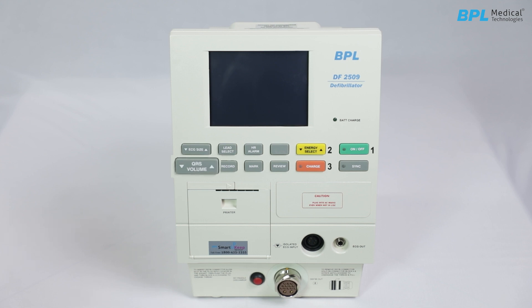QRS Volume: adjusts the volume of the QRS beep. Record: prints the current ECG data and status. Mark: stores the ECG data during printing. Review: prints an event summary record and stops the recorder during printing.